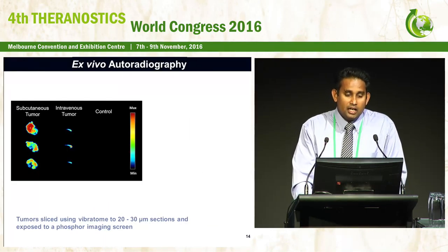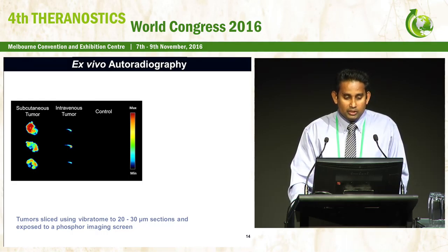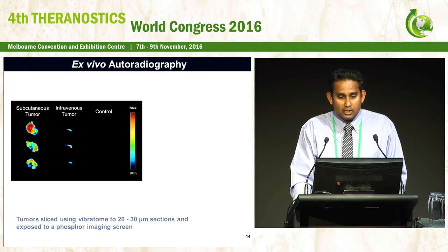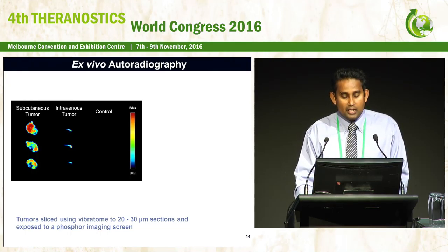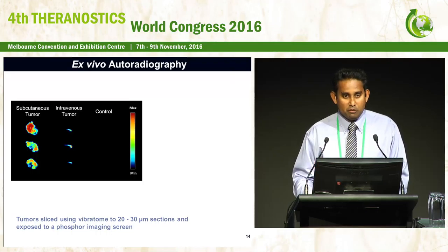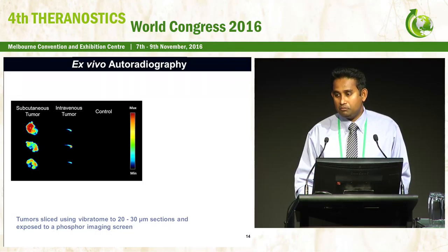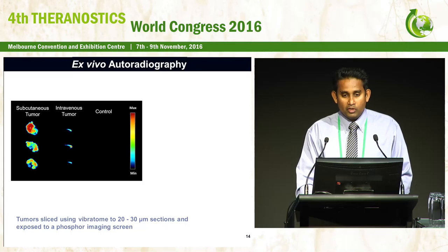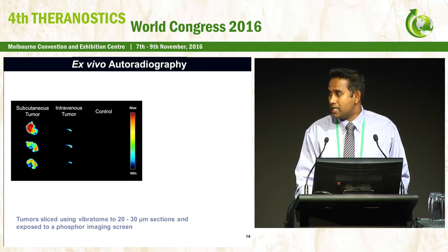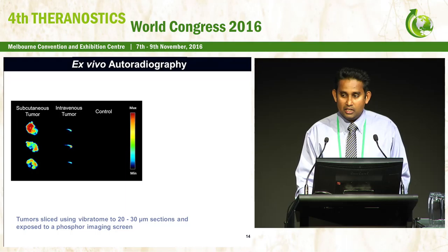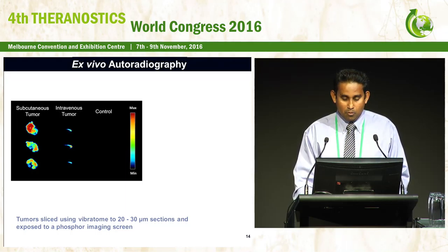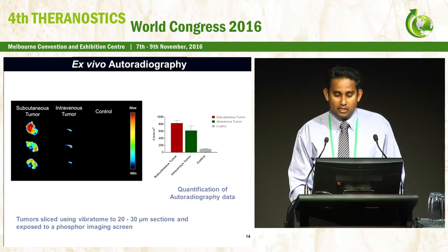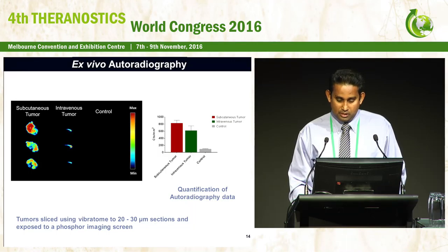We have also done autoradiography studies, comparing the subcutaneous tumor and intravenous tumor with the femur of control mice. These are sections of the same tumor, and you can see the heterogeneity of the uptake with gallium-68. In the intravenous tumor, although you cannot see the outline of the bone, these activities are within the bone region. By drawing ROIs, we can see the quantified difference between the control and the two tumor models.